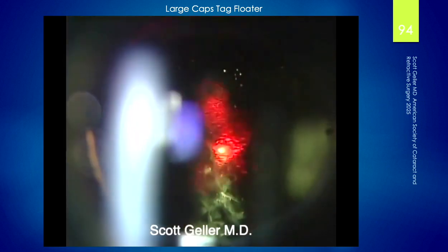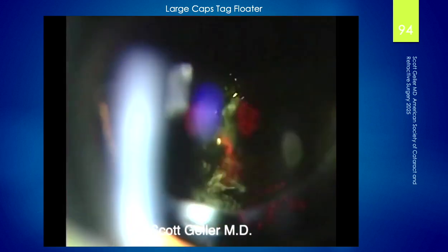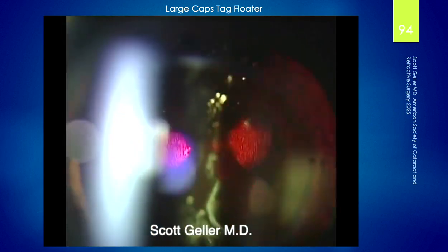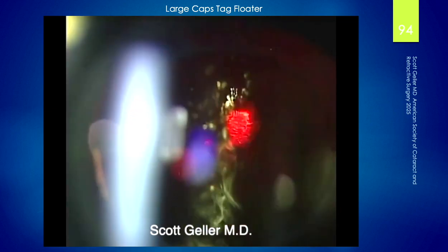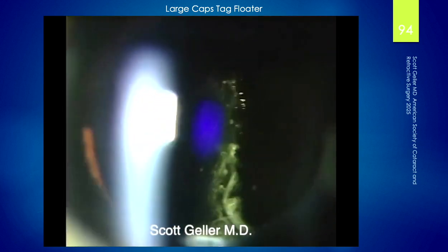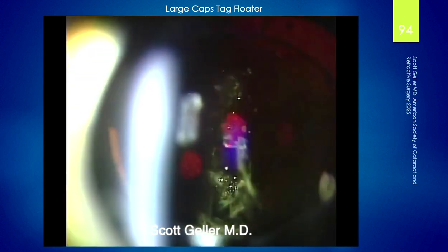In fact, I would advise anybody who wants to work with phakic patients to maybe try that on their capsulotomy patient. I don't think it's really experimenting. It's just doing a capsulotomy in a different way to see how close you can get before you cause a tear in a capsule.